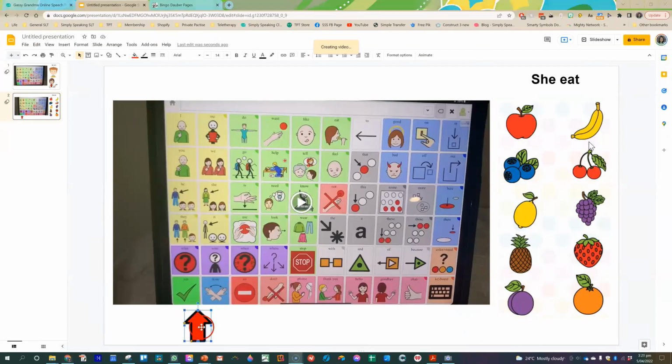If they're on an iPad for the Zoom session, it's difficult. So another great thing about this setup is when the video is not playing, you've still got a front page representation of their AAC system. So I can still model if there was a phrase I wanted to say that I hadn't filmed, like done, or anything like that. We can still move this around to model, which is nice.